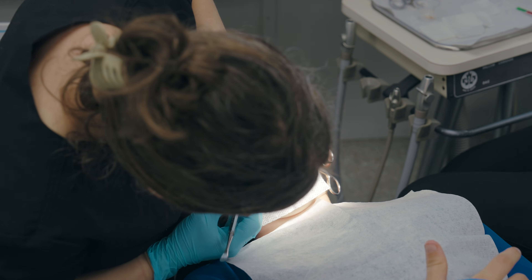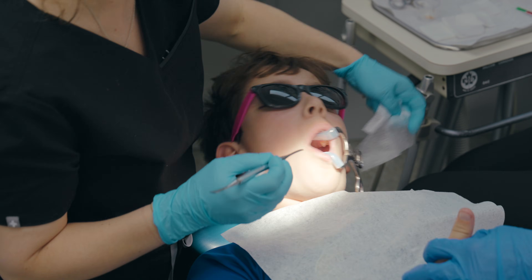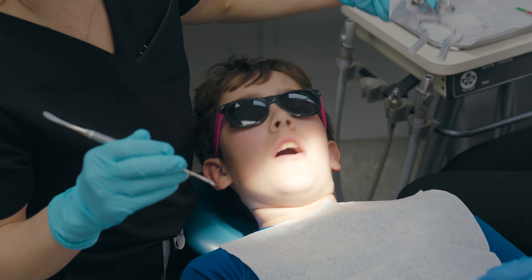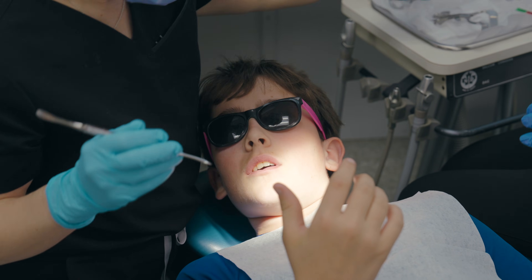The patient should be monitored during and after the appointment to ensure they do not bite, pinch, or scratch the anesthetized soft tissues causing trauma.